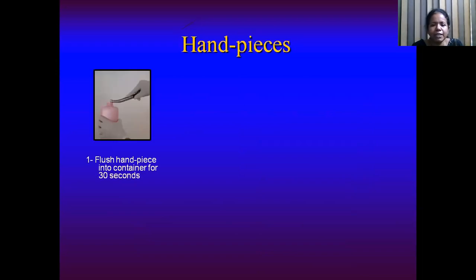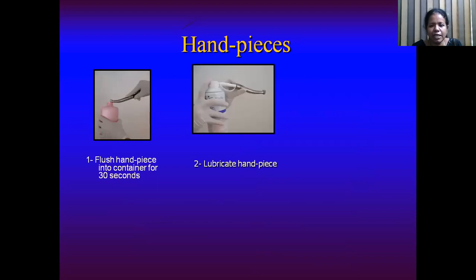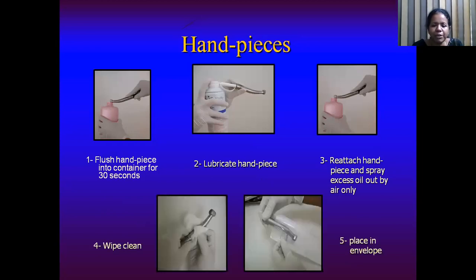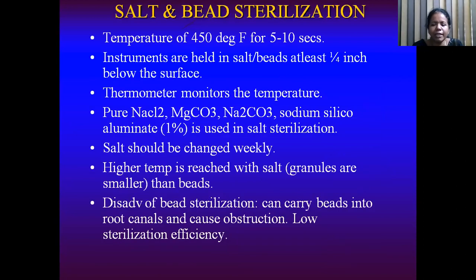Handpieces can be sterilized as follows: first, flush the handpiece after using it on the patient by running it into a container for 30 seconds. Then lubricate it with oil or spray, re-attach the handpiece, and spray excess oil out using air only. Close the water knob and remove excess oil, then wipe it clean, place it in a sterilization pouch, and subject it to the sterilization cycle.